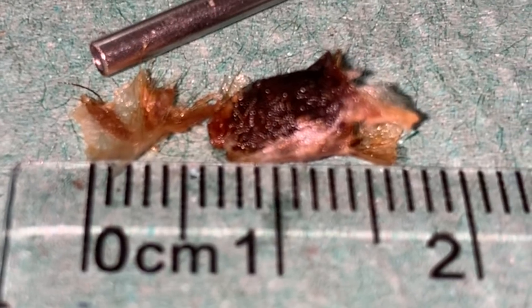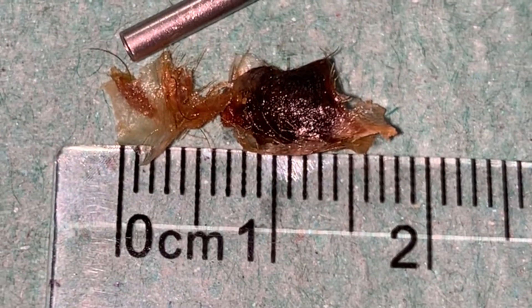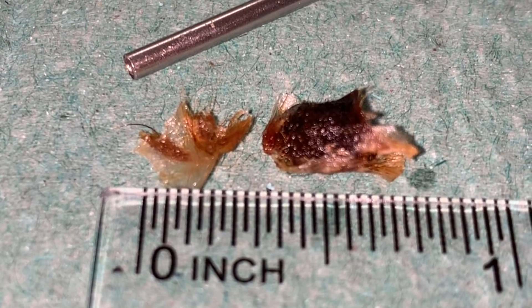And there's the eardrum. You can see how red and aggravated it is — especially along the hammer bone, all the blood vessels have come to the surface. So there we are — that's the measurement in centimetres, and it should be coming up in inches any second. Well, I hope you enjoyed day 10 and I shall see you tomorrow for day 11.